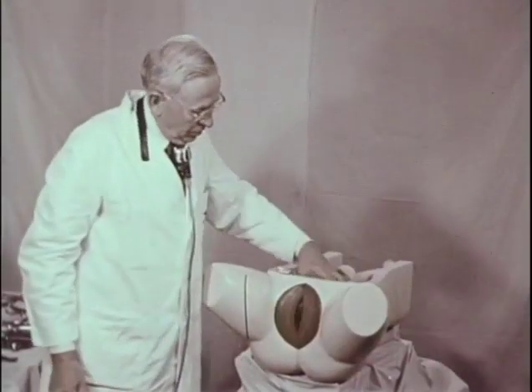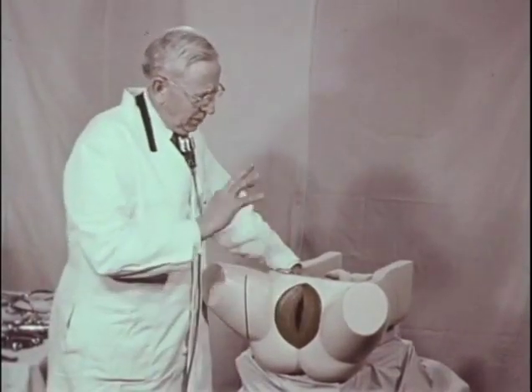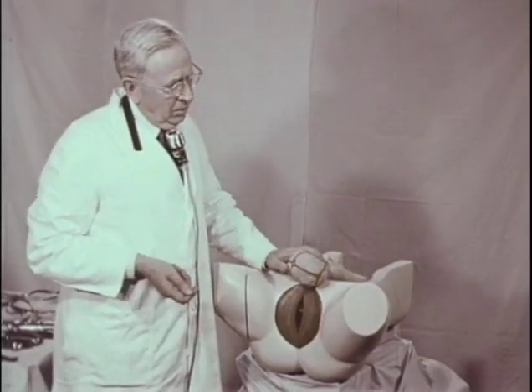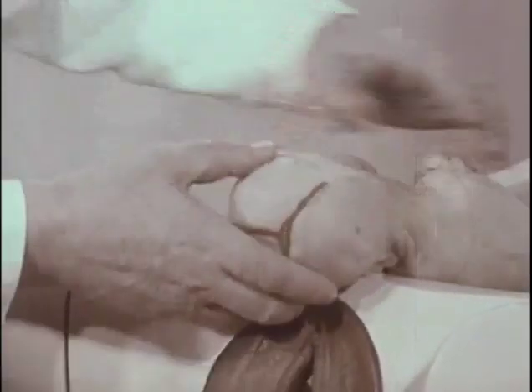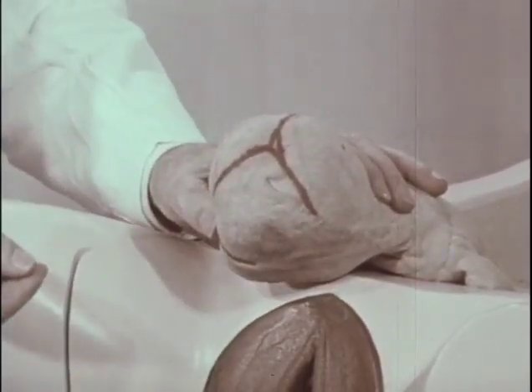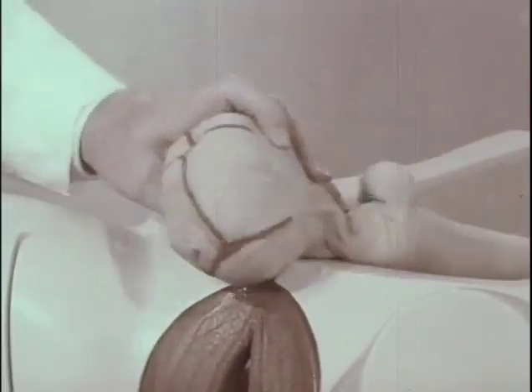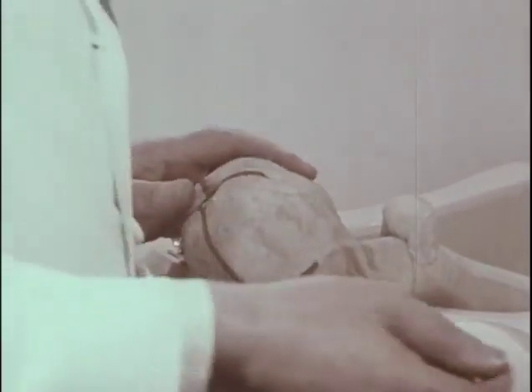The gradual maneuver is necessary because with the Simpson type of forceps, if one tries to execute a complete maneuver with a single motion, one is apt to cause injury to the vagina, because the Simpson type of forceps have separated shanks and a long tapering cephalic curve. This maneuver perhaps can best be demonstrated with the head outside the pelvis because there are multiple adjustments.